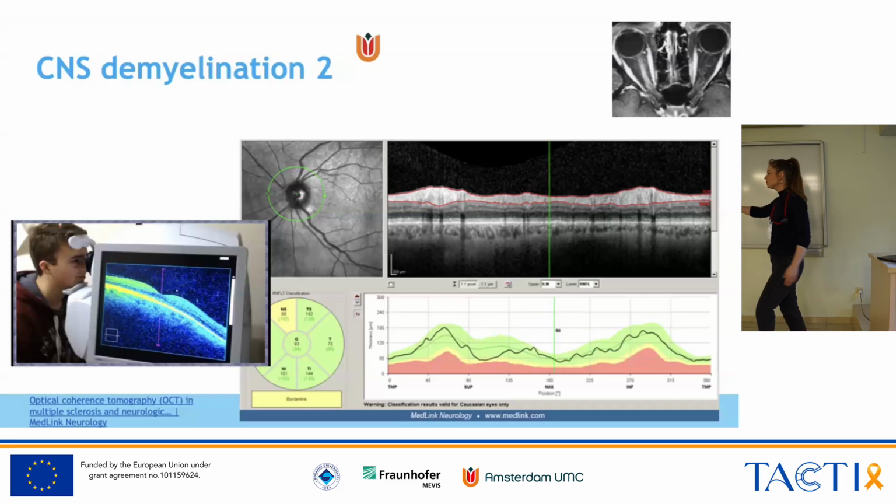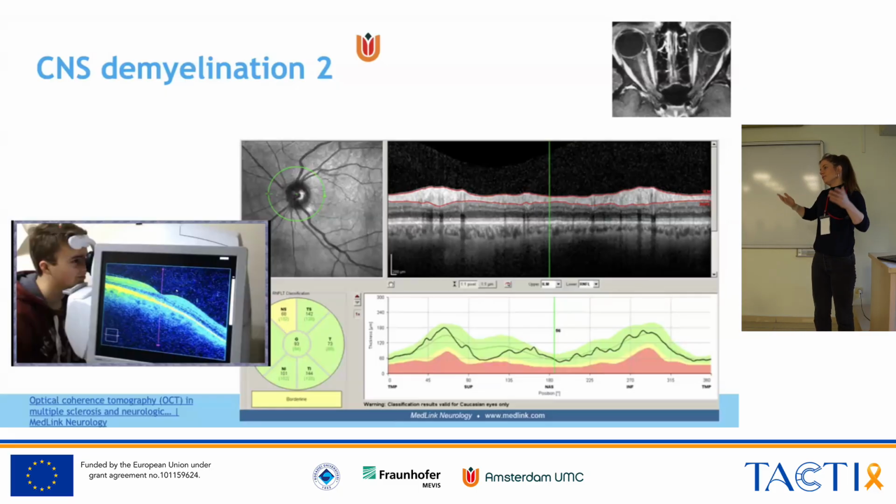You can also have thinning in eye diseases, for example in glaucoma or refraction disorders. That is why we are a little bit anxious about how things will evolve in the coming months with optic nerve imaging, because you could get patients referred with the question of optic neuritis with an abnormal OCT scan who actually have a primary ophthalmological problem. But we'll have to see how that goes after the implementation of the new criteria. It is, however, a way of imaging optic nerve damage in the past.